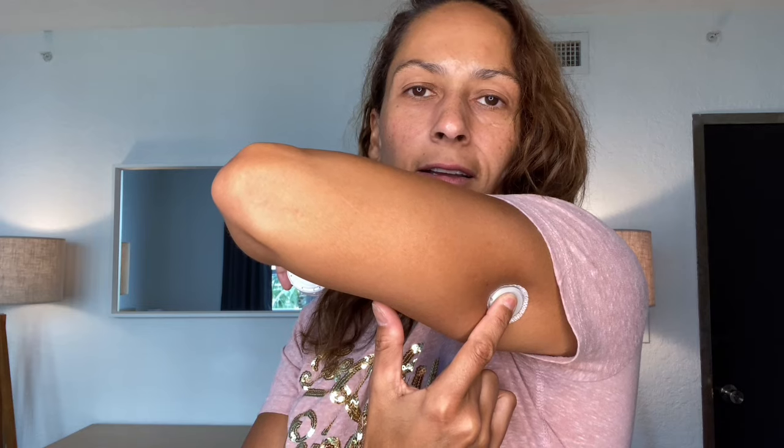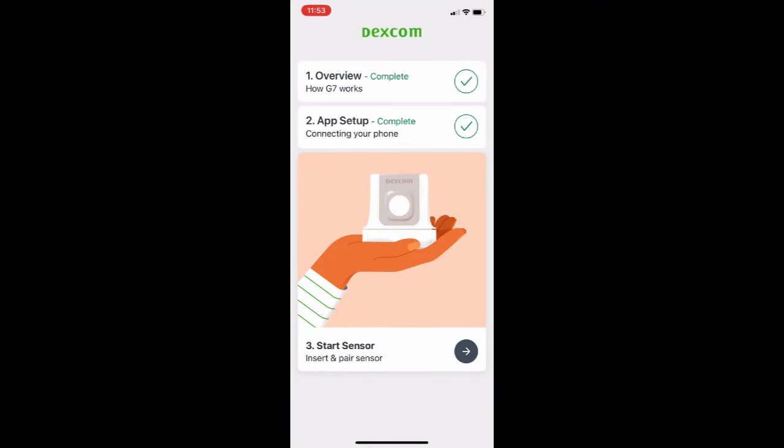Just smooth down the tape and hold the sensor in place for a bit. And we're ready to pair it in the app. Open up the app and click Start Sensor.